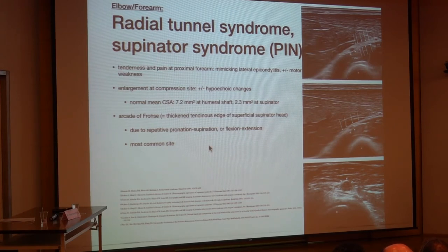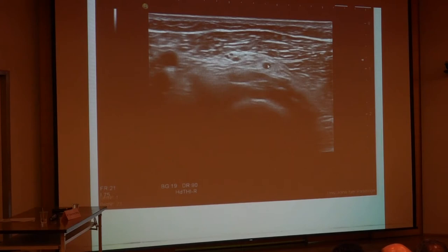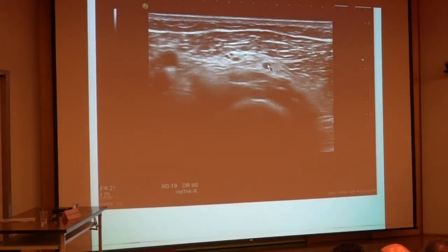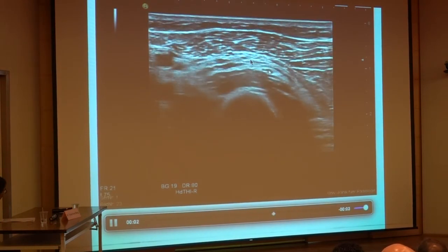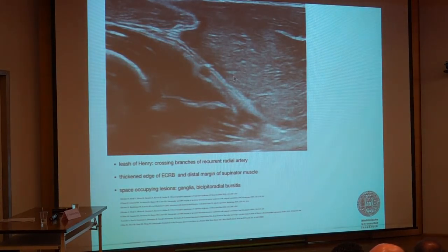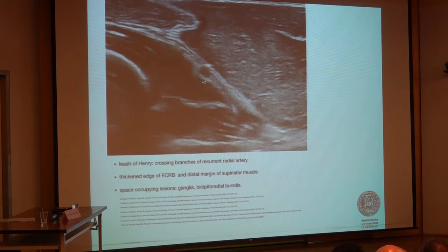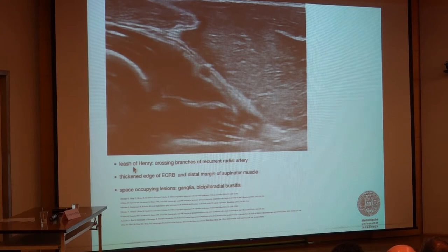It can be due to repetitive pronation and supination or flexion and extension of the arm. In the video, we can see the radial nerve coming down and then a focal enlargement nicely seen at the more proximal level, with more distal levels also possible. The etiology may also be the so-called leash of Henry, which is a thickened branch of the recurrent radial artery, or a thickened edge of the extensor carpi radialis brevis muscle, or space-occupying lesions like ganglia and bicipitoradial bursitis.